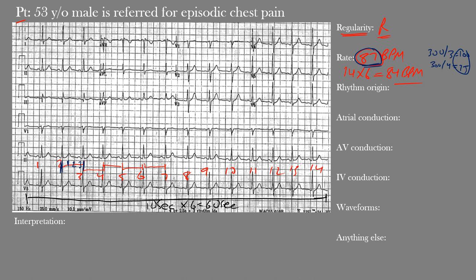For rhythm origin: we have narrow QRS complexes, indicating some sort of supraventricular rhythm — meaning it's coming from above the ventricles. We can also make out clear, similarly-shaped P waves. For sinus rhythm, we look at the inferior leads — leads II, III, and AVF — where we see upright P waves. In the left lateral leads V4, V5, and V6, we also see upright P waves.